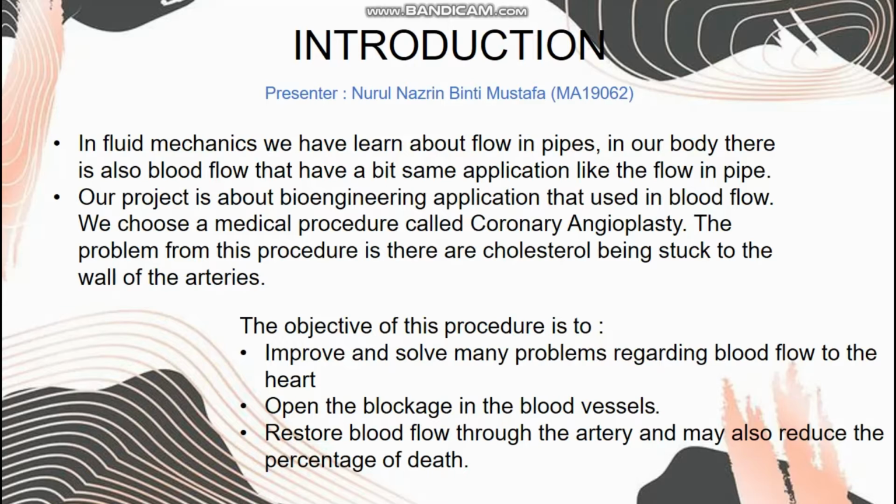The problem this procedure addresses is that cholesterol gets stuck to the walls of the arteries. The objective of this procedure is to improve and solve many problems regarding blood flow to the heart, open the blockage in the blood vessels, and restore blood flow through the artery, and it may also reduce the percentage of death.